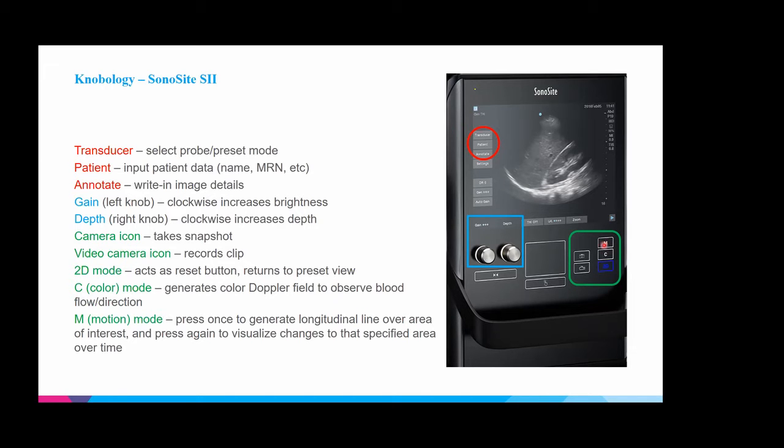And then this M, what does this M stand for? Midline? M mode. Yeah, so I heard midline, right? So actually I feel like this is a common misbelief, right? Because when you hit the M button, a line forms down the middle, right? But actually that line can be adjusted, so it can actually be moved. So you hope it's in the middle because we use it commonly when we're trying to put in IVs and things like that. But actually the M stands for motion.